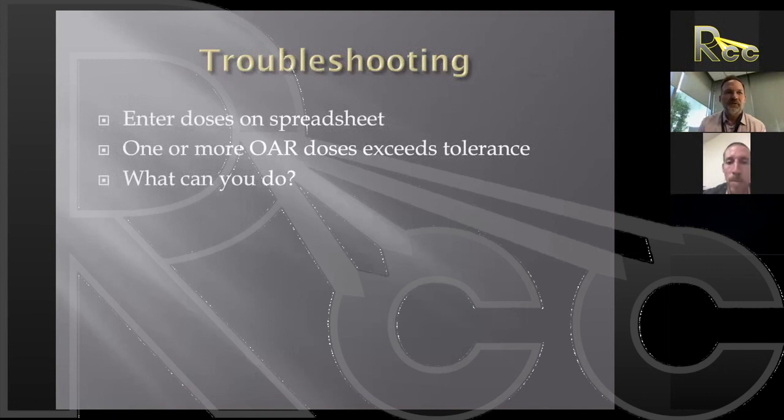We enter the doses on the spreadsheet. Even after the very first application, we carry those doses out for the remaining fractions to see if we're delivering a tolerable dose, if every fraction was exactly the same as the first one.